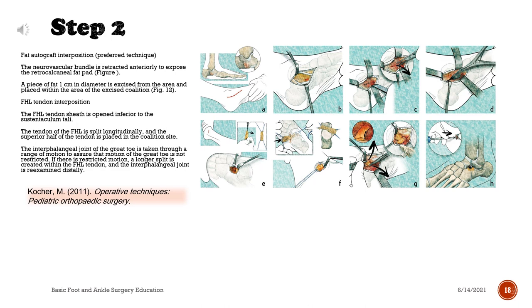FHL tendon interposition: the FHL tendon sheath is opened inferior to the sustentaculum tali. The tendon of the FHL is split longitudinally, and the superior half of the tendon is placed in the coalition site. The interphalangeal joint of the great toe is taken through a range of motion to assure that motion of the great toe is not restricted. If there is restricted motion, a longer split is created within the FHL tendon and the interphalangeal joint is re-examined distally.